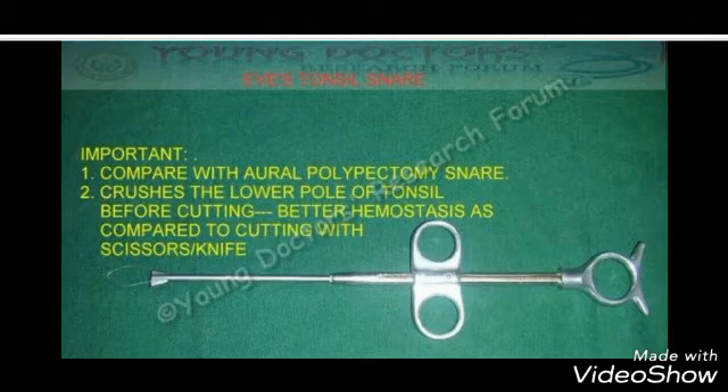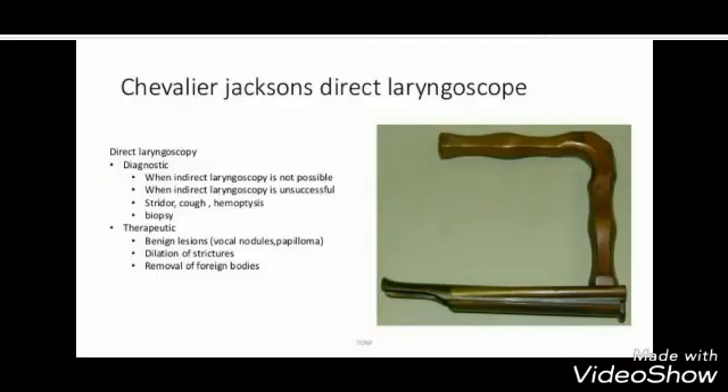It is the Eves Tonsil Snare, used for crushing the lower pole of the tonsil before cutting. It provides better hemostasis as compared to cutting with scissors.